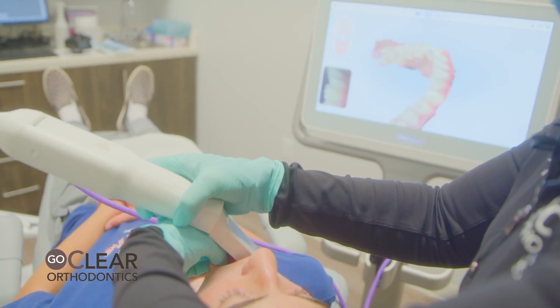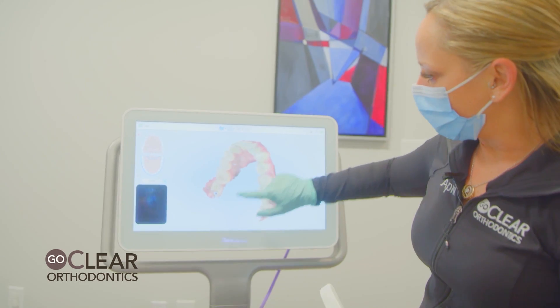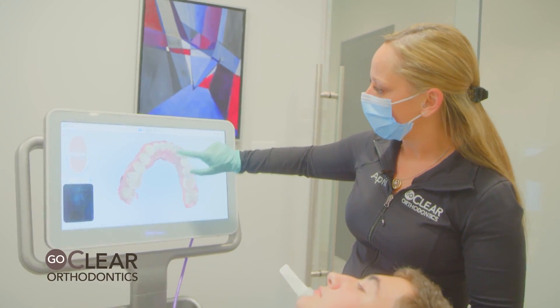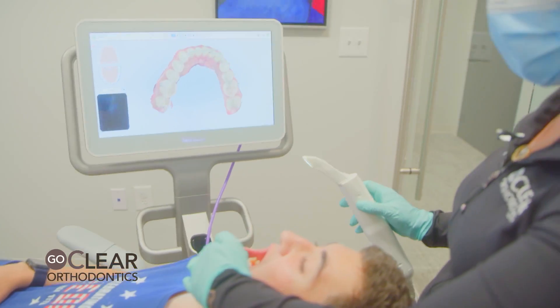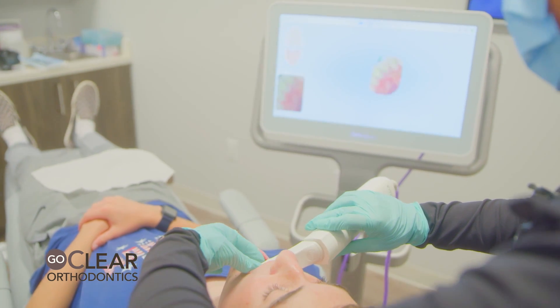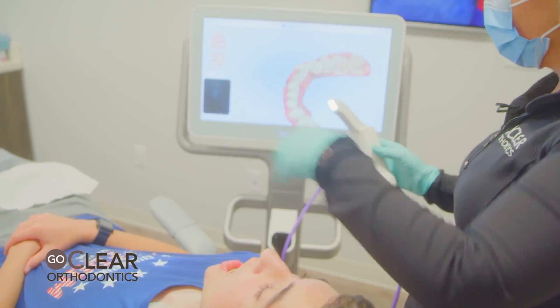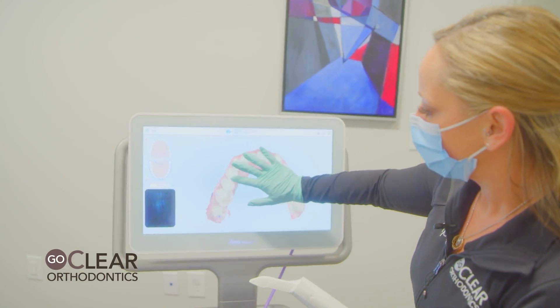Once the scanner picks up the whole arch, you're done. Now I'm going to look at the scan. I need to get this lower left second molar a little bit better. Because there's a little crowding on the anterior, sometimes you will get a blue spot there. Easiest way to fill those in will be to hold his lip away — hook him like a fish, as I like to say. Wand tip goes on the lingual and you roll to the facial. That blue spot is already filled in. Once you fill it in, stop — don't keep going or you're going to end up with lip, cheek, and gloves in the scan that you do not need.